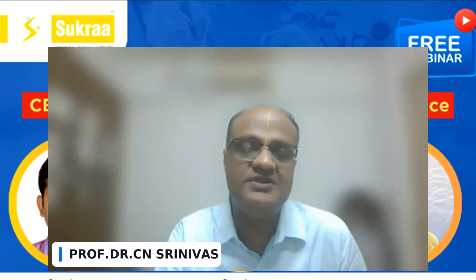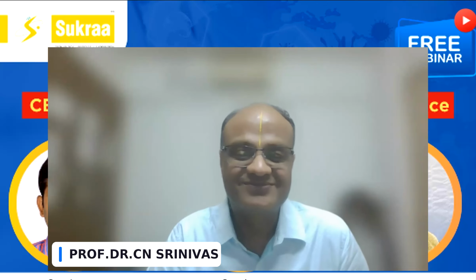Naveen, how do you tackle when you see platelet clumps? So this is the first question which I asked when I started seeing peripheral smear. As soon as I passed out of college and we had the responsibility of reporting with our name on it, how will you take the blame? During my practice, I came to terms that when we are seeing clumps, definitely we have to mention that on the smear so that the clinician who is treating the patient will know whether the count is completely free or if there are any interferences.